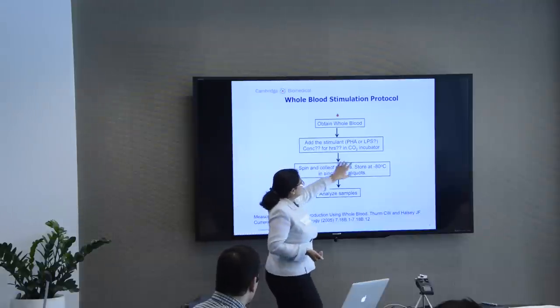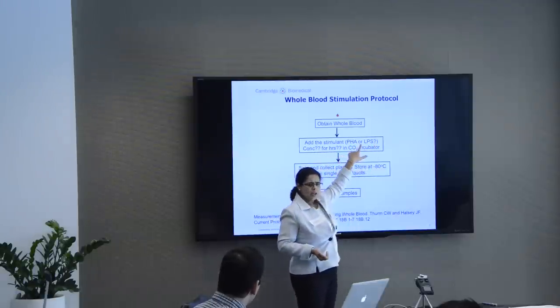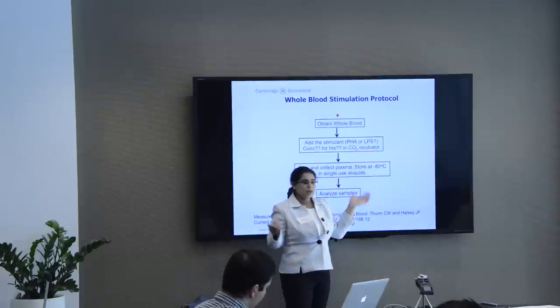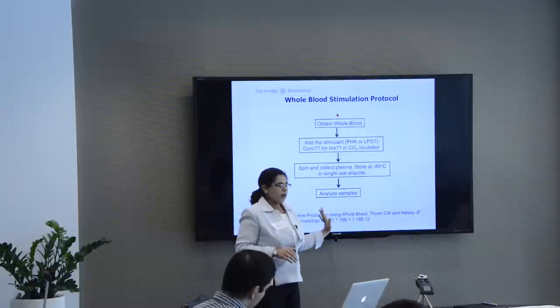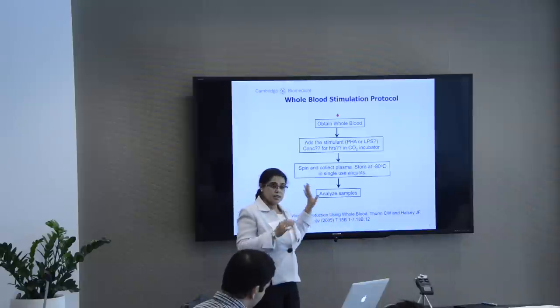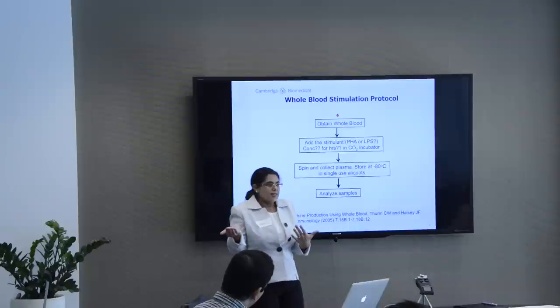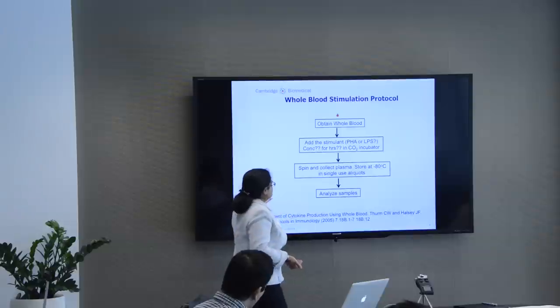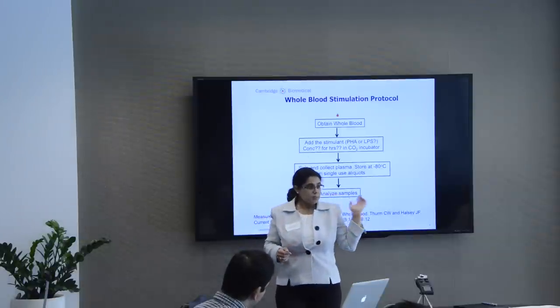But look at the question marks here. Are you going to use just PHA or LPS? Both of them? This is what we see. You use PHA, you upregulate certain cytokines, not all. You use LPS, it down-regulates certain cytokines that PHA upregulates, and it doesn't stimulate all the other cytokines that you're interested in. What concentration are you going to test? They're going to be different concentrations for PHA and LPS.